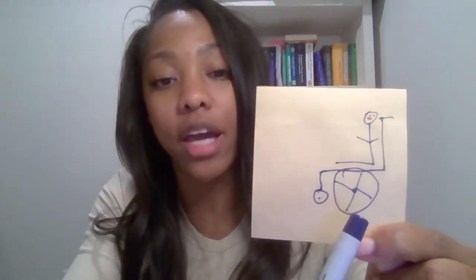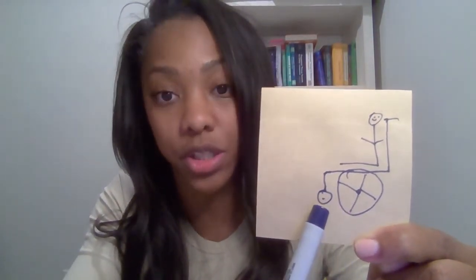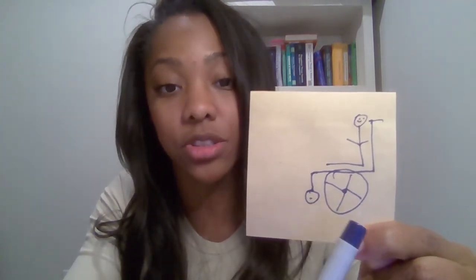And it's not like a dramatic difference. So don't think it's a huge difference when you're moving. It's literally a matter of a few inches, okay? There we go. There's our client. So we've moved the drive wheel closer to the casters, okay?